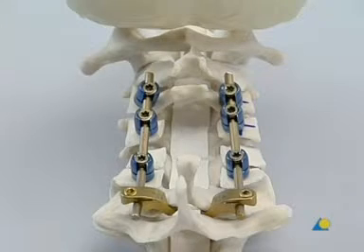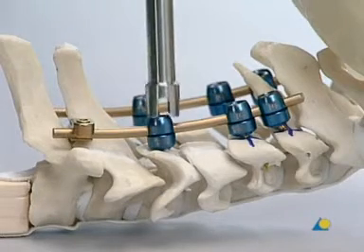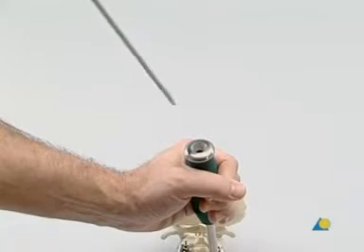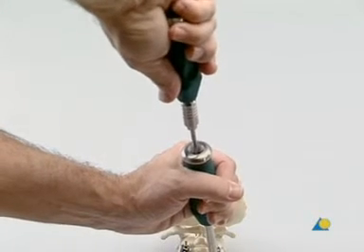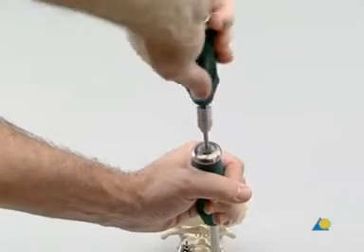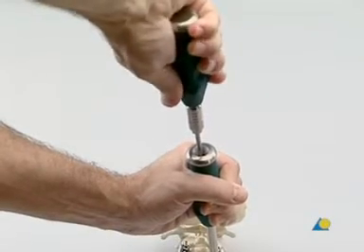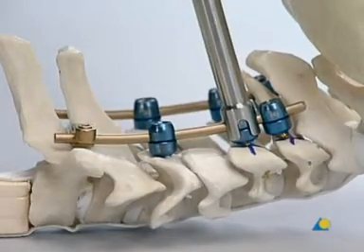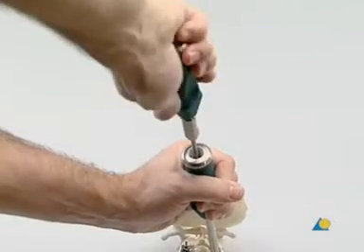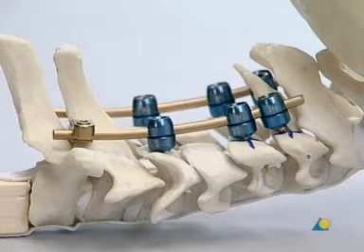The left side is instrumented in the same way as the right side. The final tightening of the locking screws in the variable axis screws is done using the star drive screwdriver with the torque limiting handle. The rod pusher used to provide counter torque is placed over the screw head. The screwdriver is inserted through the rod pusher and tightened until there is a click in the torque limiting handle. The screwdriver is removed using the rod pusher to provide counter force. These steps are repeated on all the screws. The stabilisation between C3 and C7 is now complete.